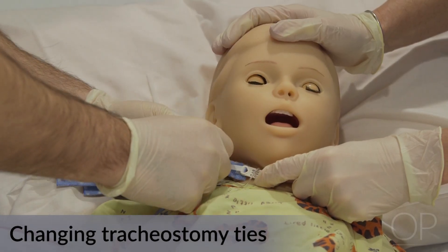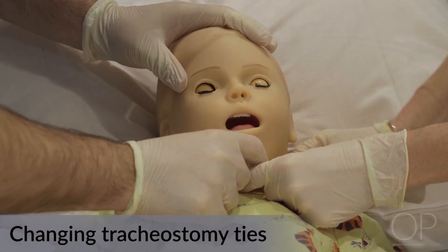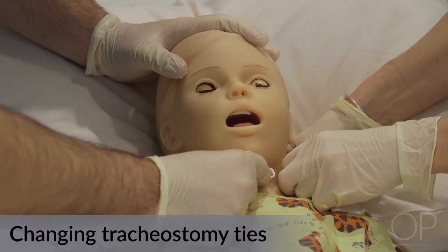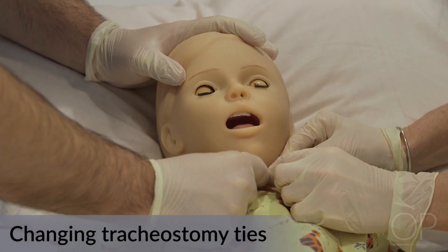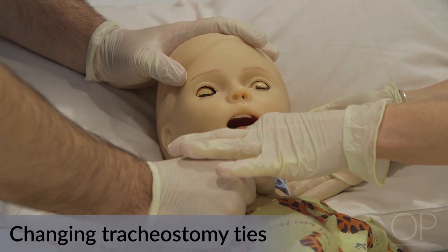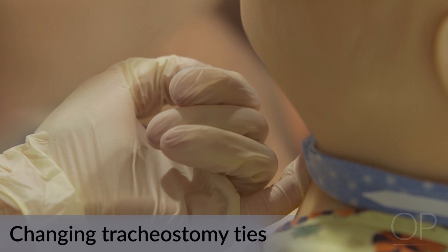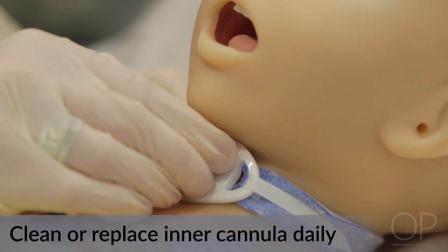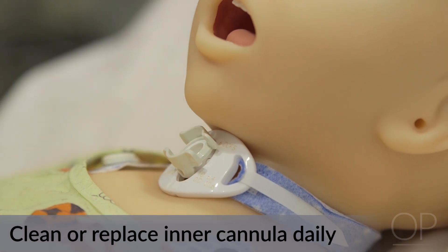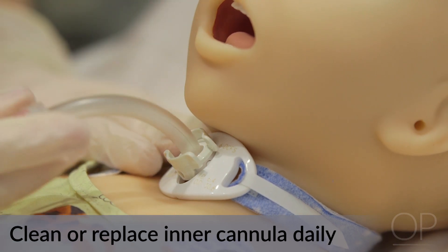Removing tracheostomy ties is always a two-person procedure. This procedure can be performed by any combination of nurses, respiratory therapists, or caregivers. Ensure that only one small finger thickness can be inserted between the neck and the tracheostomy ties in the sitting or side-lying position. The inner cannula of a double-lumen tracheostomy tube is cleaned or replaced at least once a day and as needed. A nurse, respiratory therapist, or caregiver can change the inner cannula.